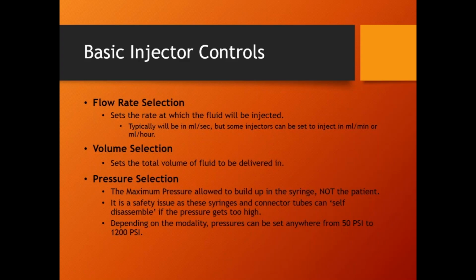Because if you think about it, I'm getting a little advanced here. I mentioned earlier, let's say there's 300 PSI pressure built up in the syringe. But as soon as it gets out to the thin tubing, the pressure has dramatically dropped, if there is successful flow. If at the end of here, fluid is trickling out, what I said is true: maximum pressure here, minimum pressure once it gets out. If, for whatever reason, there's a kink or a blockage of this fluid line, that is out the window. Whatever pressure is in here is all the way up to that blockage.